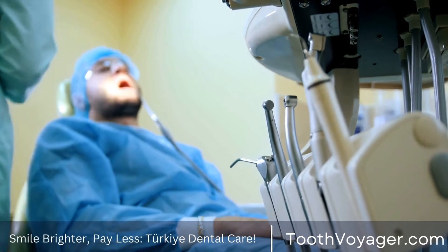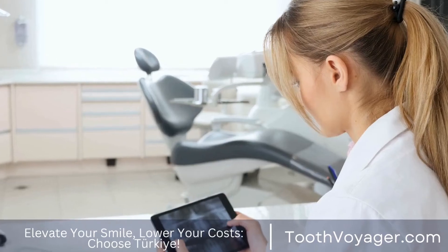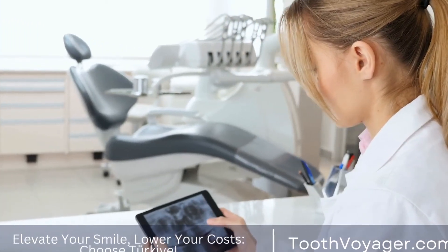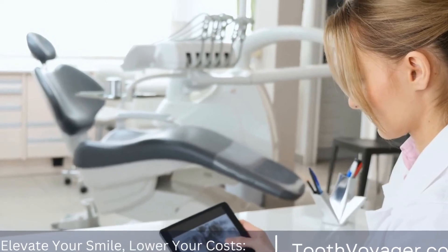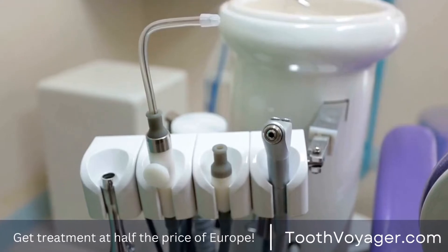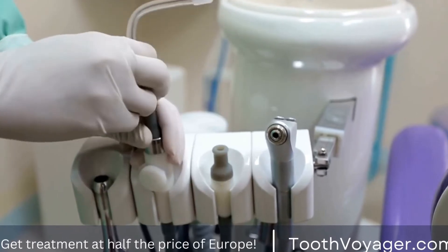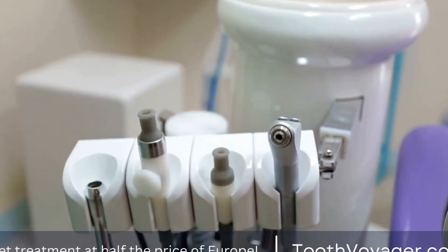Step 2: Anesthesia. Before the root canal procedure begins, your dentist will administer local anesthesia to numb the area around the affected tooth. This will ensure that you do not experience any pain or discomfort during the procedure.